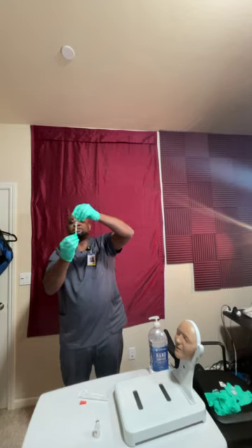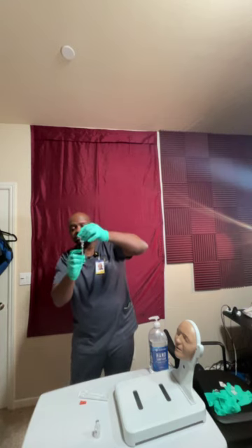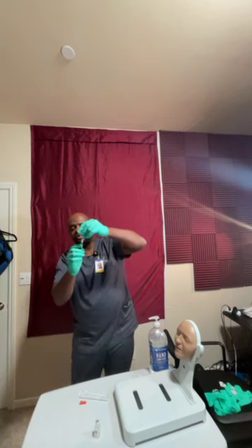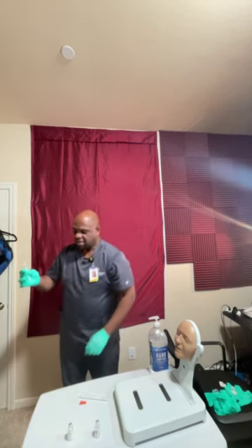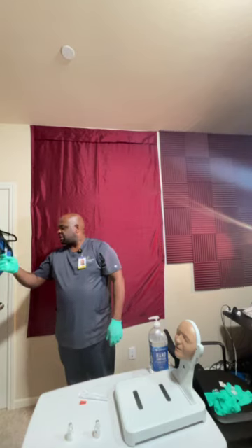Okay. 8 units of NPH. Now I want to make sure that there's no bubbles in that one either. I'm going to tap. Right, but the key here, I will not be pushing on the plunger to put any medication back in this bottle. I'm going to let the other fellow nurse see the syringe so that they can compare and check the doctor's order, or check the MAR, and confirm that this is the amount. So just like for both of these, we let the fellow nurse see it, and we confirm with the doctor's orders. Everything looks good. Let me show you guys first, right? There's 8 units, right? Let's show you there, 8 units.